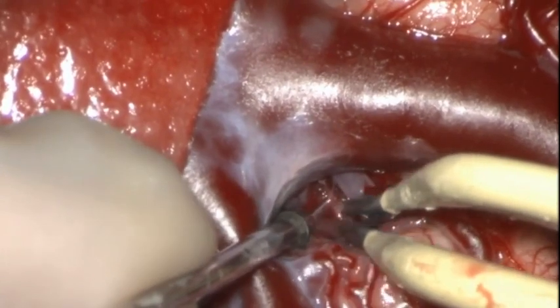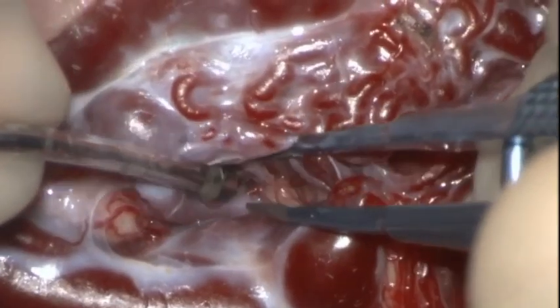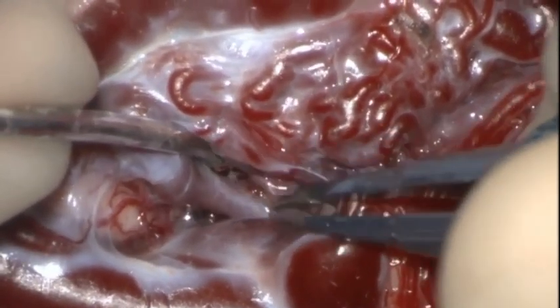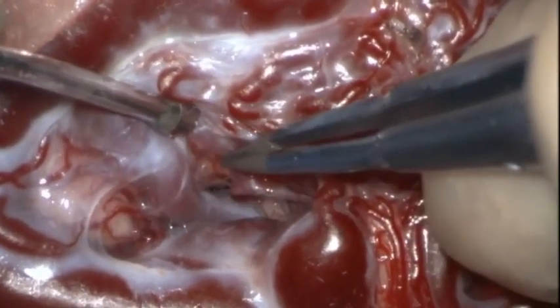Once exposed, the draining veins must be recognized and preserved. This is the fundamental tenet of any AVM surgery. Vessels larger than 4 mm should be considered a vein until proven otherwise. For this lateral parietal occipital AVM, veins drain into the posterior and anterior parietal veins as well as the postcentral veins.